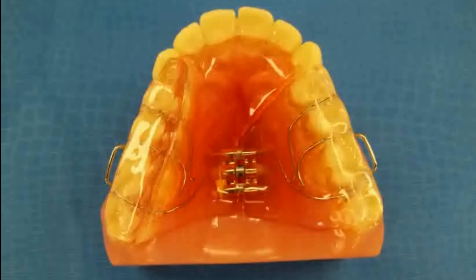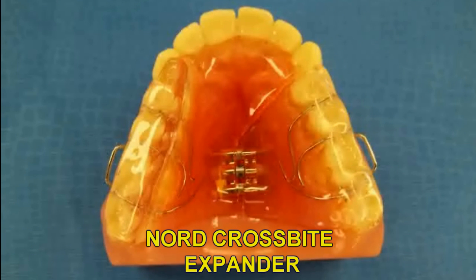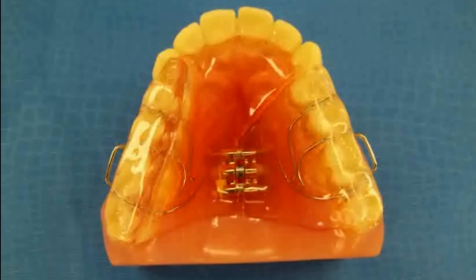If you have a case with a true unilateral crossbite, this Nord crossbite appliance can help you correct it. The first thing you'll need to determine is if the patient has a true unilateral crossbite or if he has a bilateral crossbite with a functional shift.